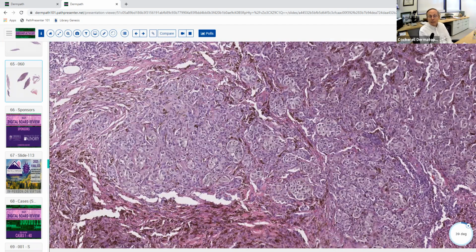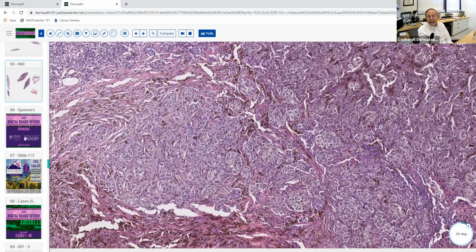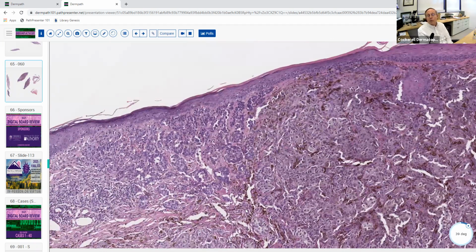Superficial spreading melanoma. So that's a more sophisticated question. They're asking the differences between two different types of melanoma. And superficial spreading melanoma tends to have a lot of pagetoid spread with a lot of large pagetoid cells. Here we don't really have that. Here we got these more epithelioid, large round melanocytes and small round melanocytes. So that would not be the best subtype of melanoma, but they probably aren't going to ask you to differentiate between the types of melanoma.